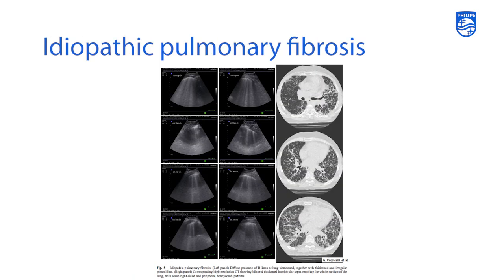Now compare that to a patient with idiopathic pulmonary fibrosis — how the CT scan looks and compare that with the ultrasound images where you see very clear subpleural consolidations and pleural line abnormalities, with non-homogenous distributions of B-lines and areas of spared lung. You can even see areas of pulmonary consolidation here, which we have not yet covered but will cover in another talk.